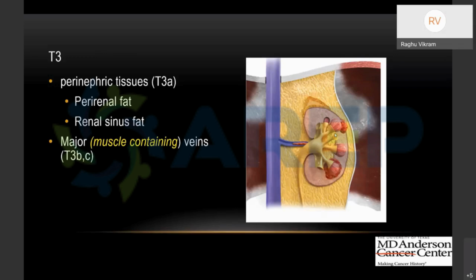If it goes into the renal sinus fat, he or she will remove it anyway, but the surgical planning might take a little longer. Or if it is in the renal sinus fat, our interventional radiologist colleagues, if they have to do an ablation, may have to be even more careful, right? So those are all the kind of things that we talk about.